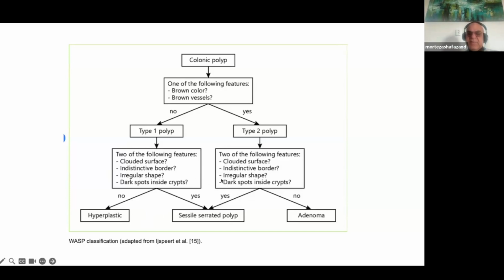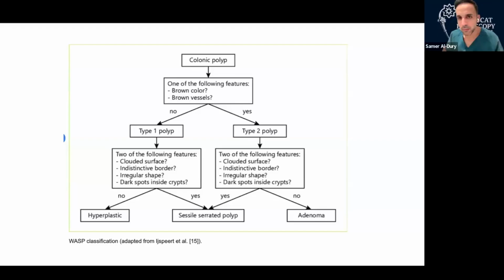But if it's getting bigger, then you have to slow down again, look at the whole lesion, put the acetic acid on it, and make sure that you see the whole lesion in front of you. Turn the patient's position if you need to see the whole lesion, so that you make sure it's not a lesion turning to dysplasia, because your choice of treatment is different then.